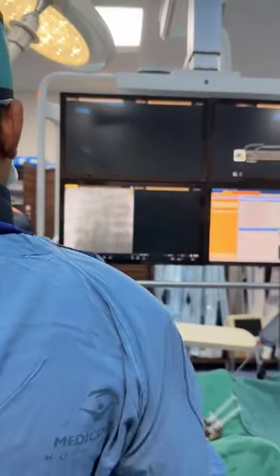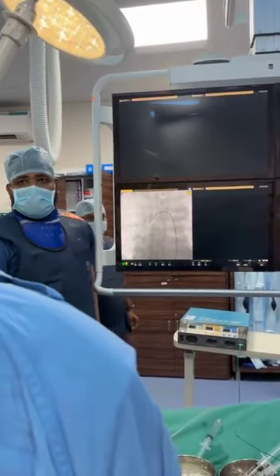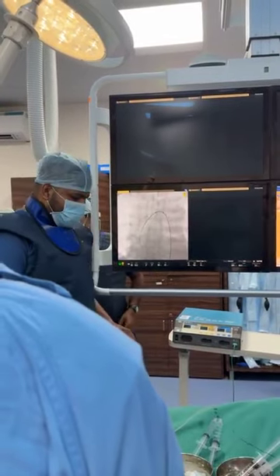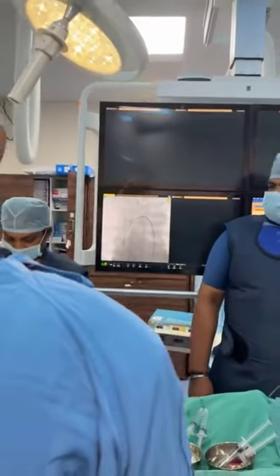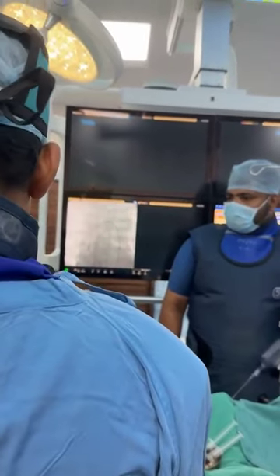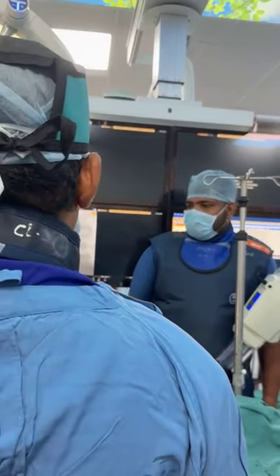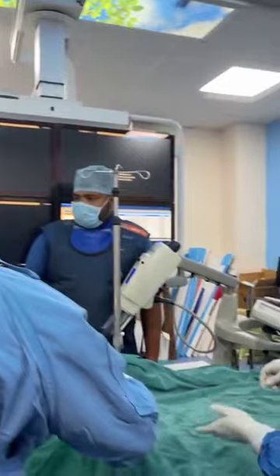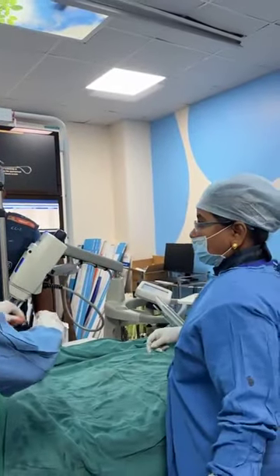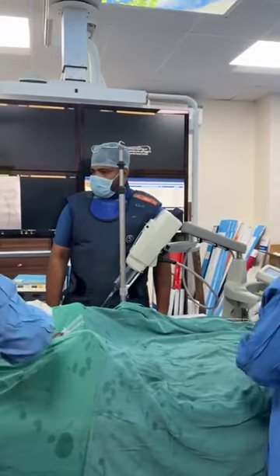Plugging required or not required for the subclavian? We can put a vascular plug at the origin of the subclavian, looking at the vertebral artery distance. Vertebral distance looks reasonable.